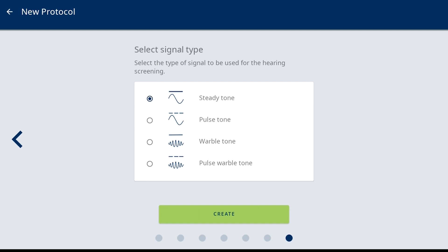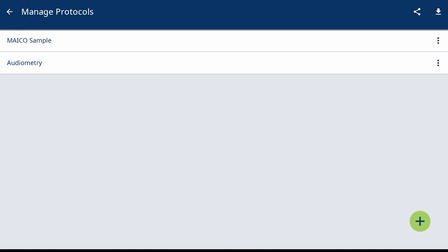Once all selections are made, select Create to save the protocol and return to the protocol list. If another protocol is required, select the Add button and continue to create.